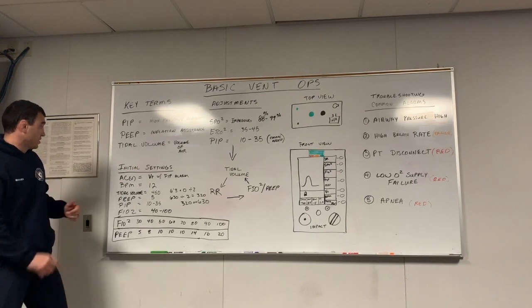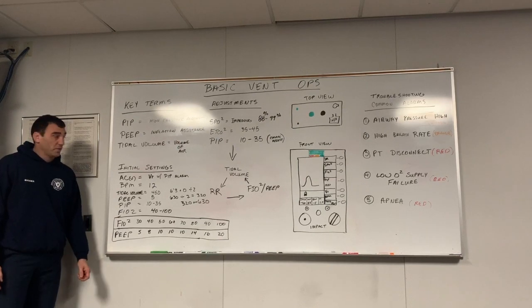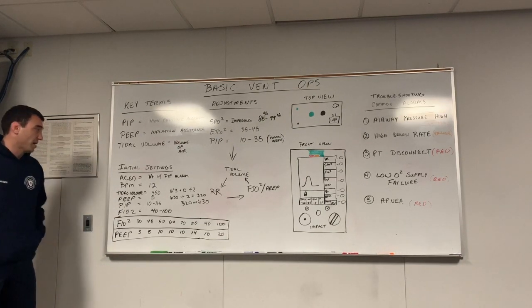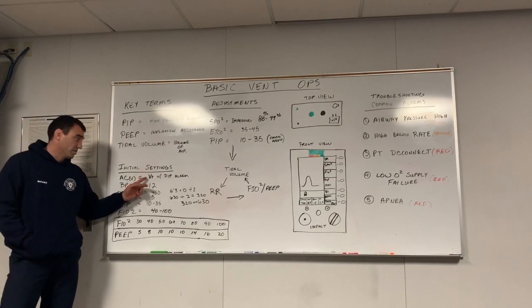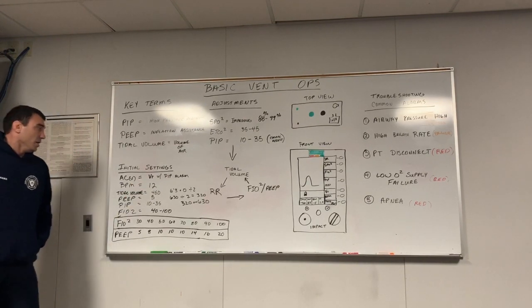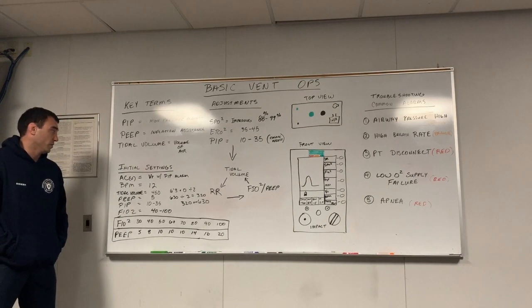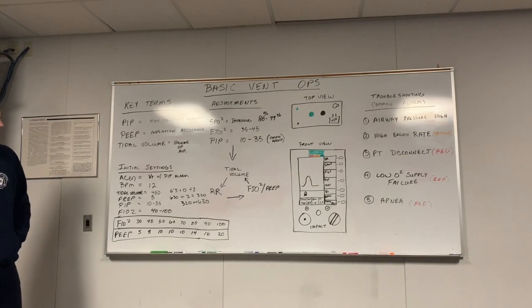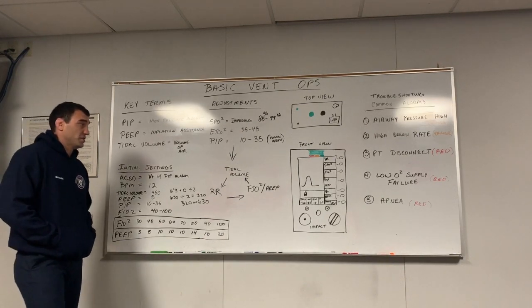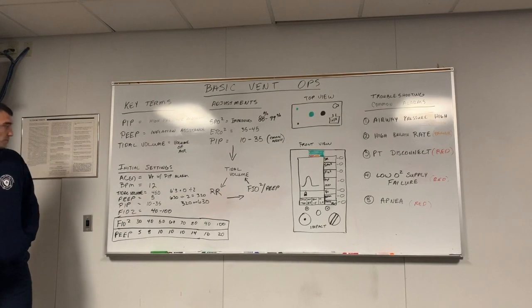Okay, so as I said, we're going to use this in AC mode. So you'll see on the ventilator, it's labeled AC and it has a V in parentheses. The V stands for volume. Okay, so what that means is the ventilator is going to deliver your tidal volume, if you're not familiar with this, the V with the small t, that's the abbreviation for tidal volume. It's going to deliver a certain tidal volume with a PIP alarm. So it will deliver air until it reaches that tidal volume, and you have your PIP alarm as your high pressure alarm.